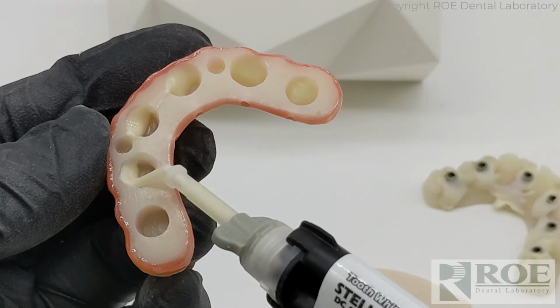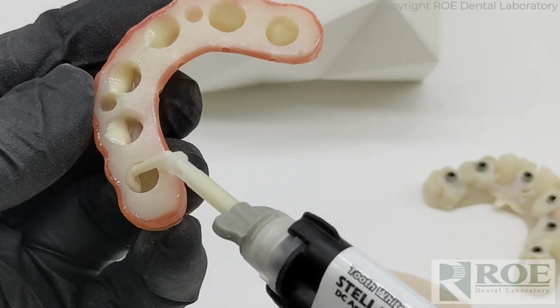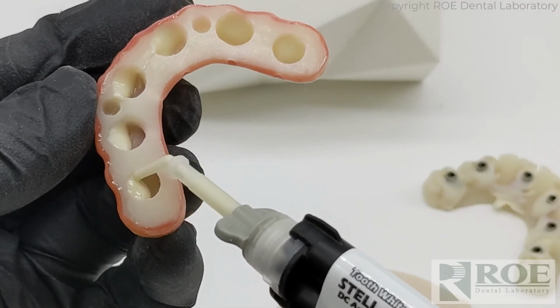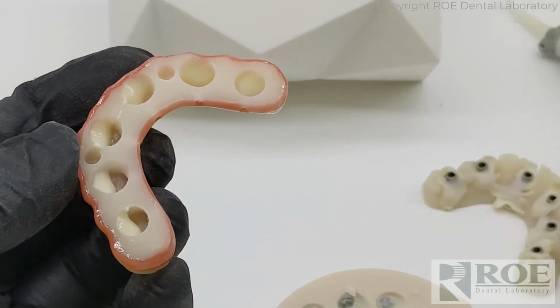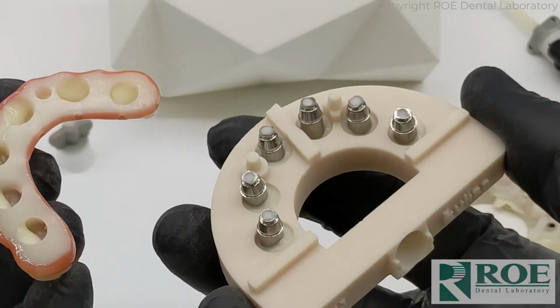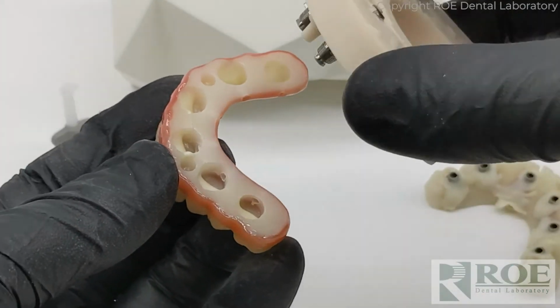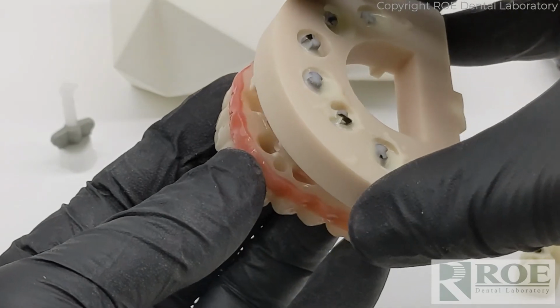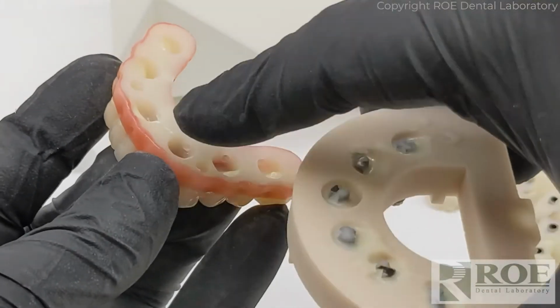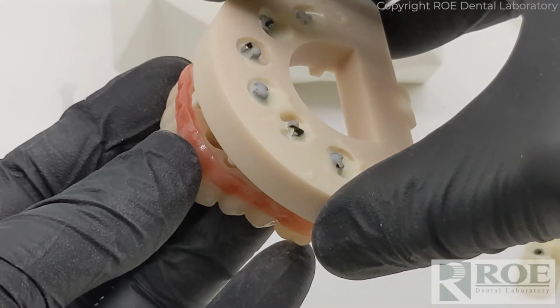And normally this would be pink. Just happen to have a white tube handy, so I'm doing white. But usually it'll be pink, unless it's an FP1 prosthetic. Okay, so that looks good. And then we don't want to flip this, because we don't want any gravity taking the material down to the model and locking it in. So we're going to introduce it this way. Okay, so you line up the chrome. Here, let me remove a little bit of extra material there. We don't want to lock it to the model.